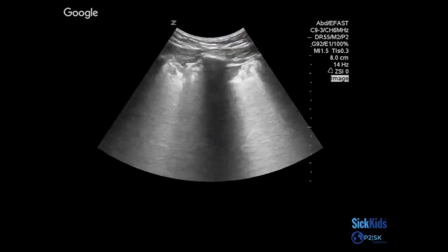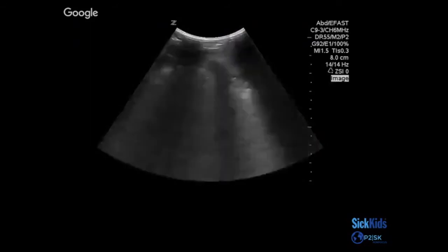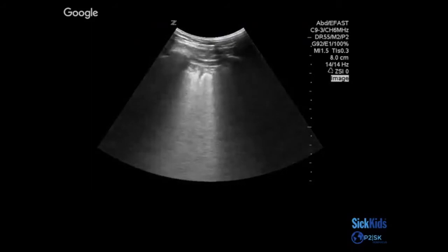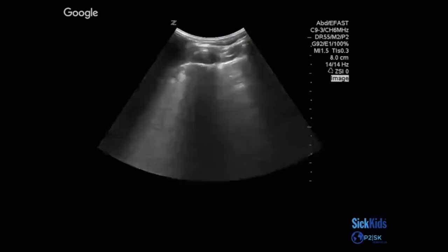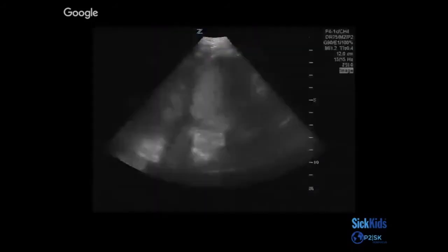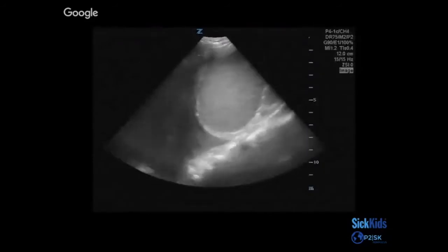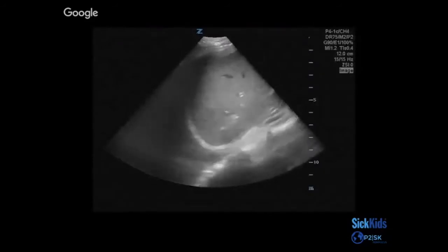This is actually a trauma we recently had where this child had findings very suggestive of pulmonary contusion. Versus this other finding — if you saw this instead, what would you be more suspicious for?